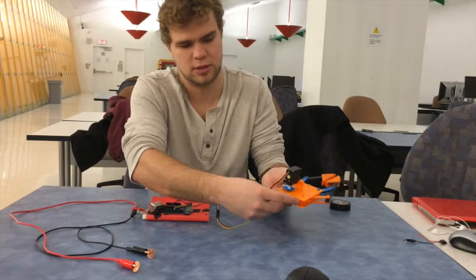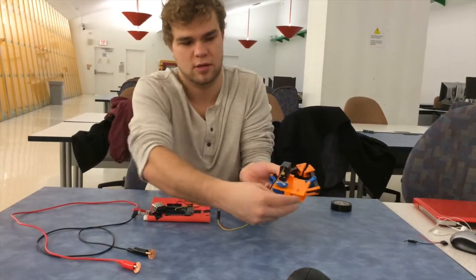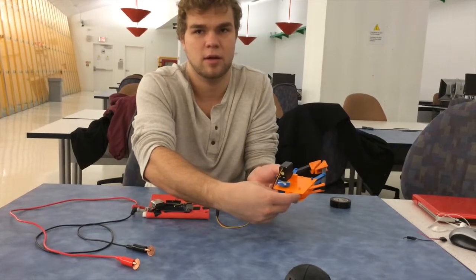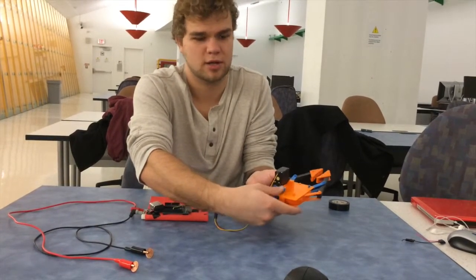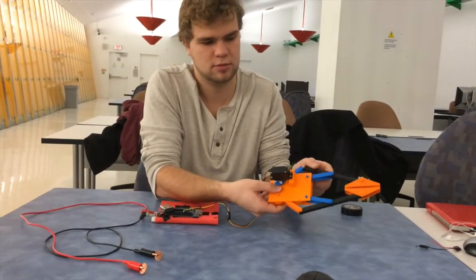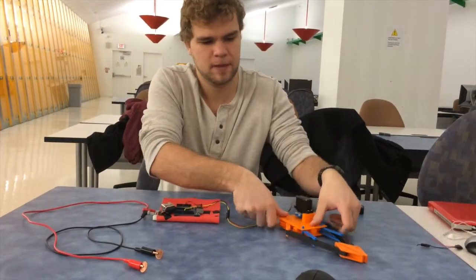And it's controlled using these two gears. One's driven and one's just linked in, so it'll move at the same speed but in the opposite direction as the driven gear, which operates the claw arms and is able to grab things.